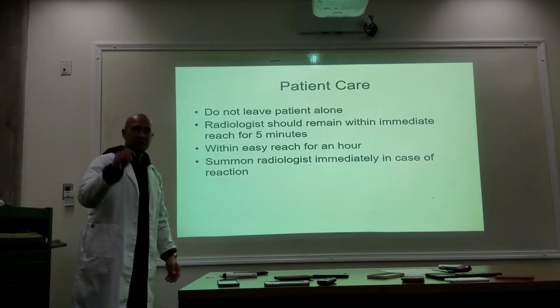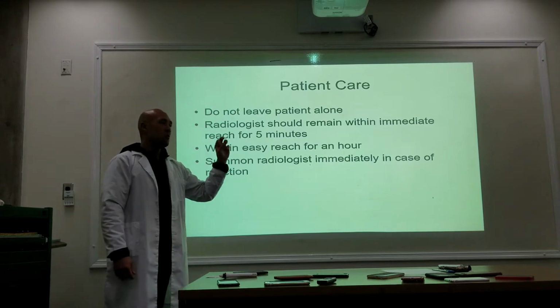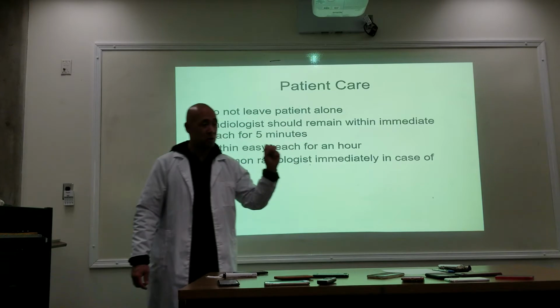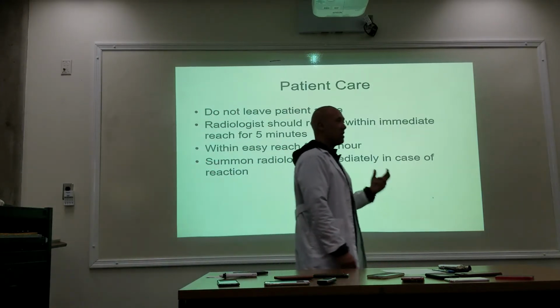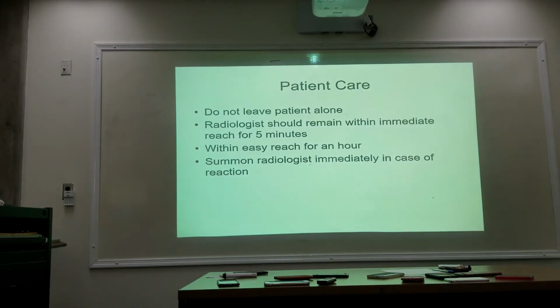Now, I'm just going to throw something up in the air. So again, that's your normal routine. You're done with your 20-minute obliques. But you're not seeing the kidneys fill. You're not seeing the ureters fill. So that's usually indicative of the patient having a stone or a blockage. Now what?